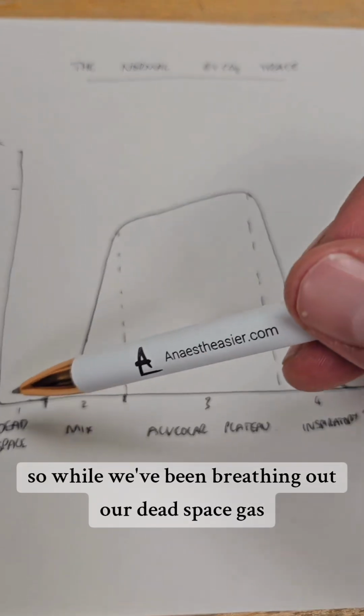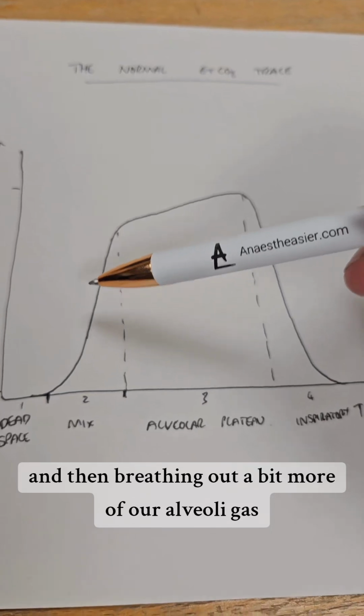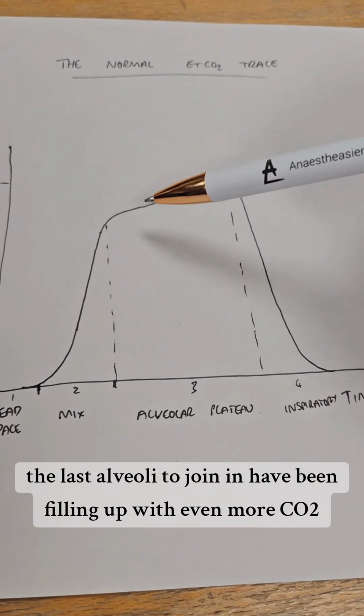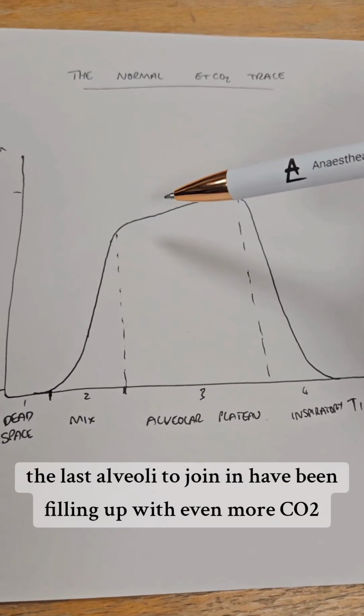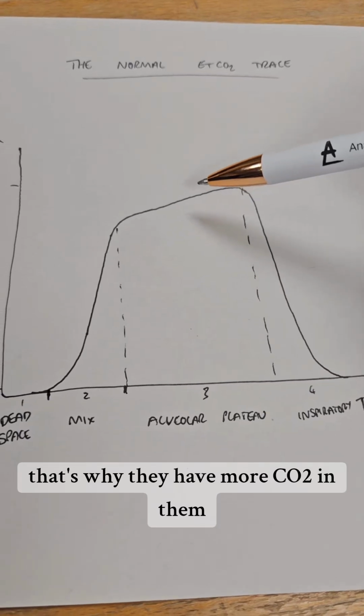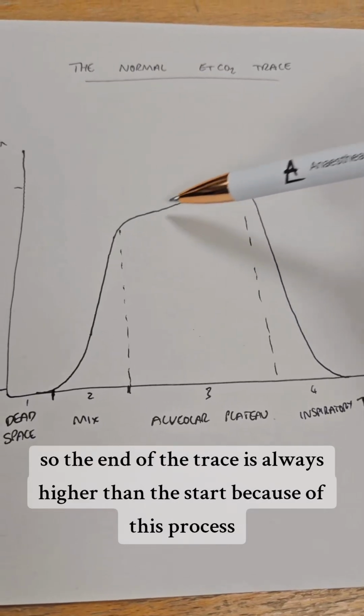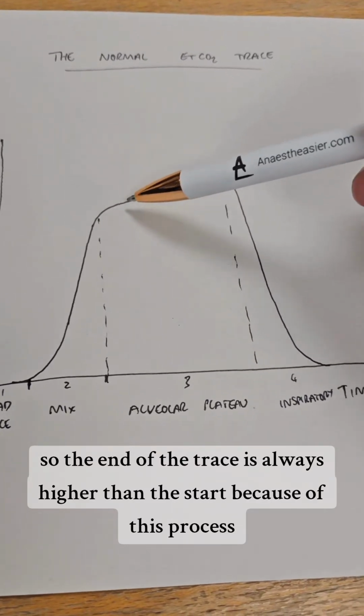So while we've been breathing out our dead space gas and then starting to breathe out our alveolar gas and then breathing out a bit more of our alveolar gas, the last alveoli to join in have been filling up with even more CO2. That's why they have more CO2 in them, and as a result, the measured reading is higher. So the end of the trace is always higher than the start because of this process.